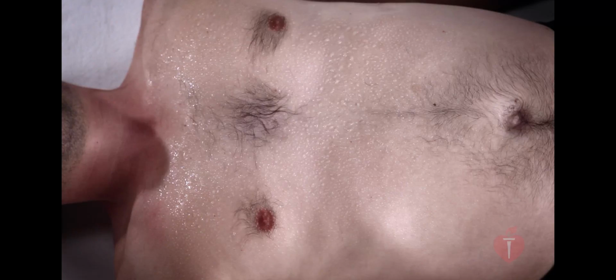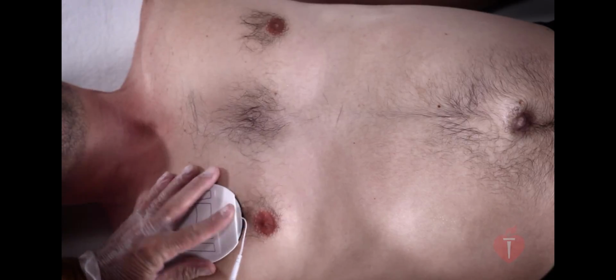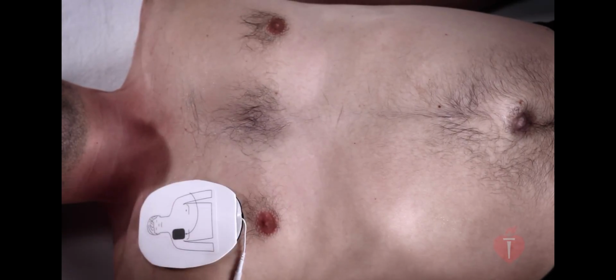Water on a victim's chest can also be a problem. It could allow the shock to travel through the water between the pads, ultimately preventing delivery of an effective shock dose to the victim's heart. If someone is lying in water, you should quickly move the victim to a dry area. However, if the victim is lying on snow or in a small puddle, you may use the AED. And if the chest is covered with water or sweat, wipe the chest before attaching the AED pads, but wipe the chest quickly. It doesn't have to be completely dry.